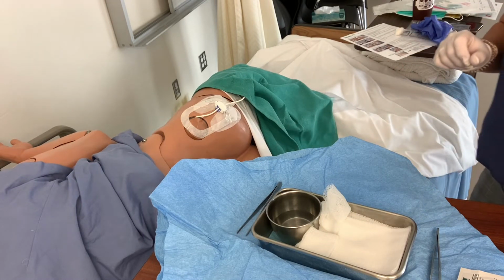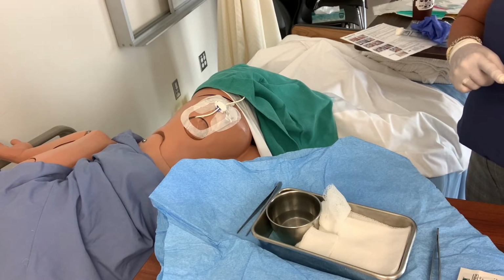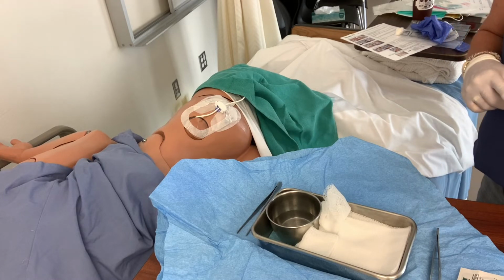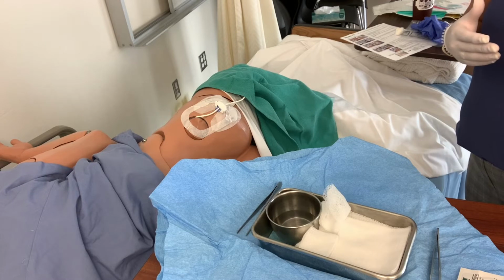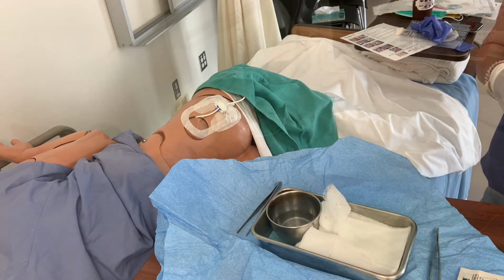The key to it is: read your policy first, gather the supplies that you need, figure out what you're going to remove with blue gloves, set up your supplies, and once you put the sterile gloves on, you're sterile, so you want to complete the dressing and keep as much sterility as possible. Because this is in a body cavity, we do not want to be careless with it. It can cause the patient more harm than good. So that's the dressing change.